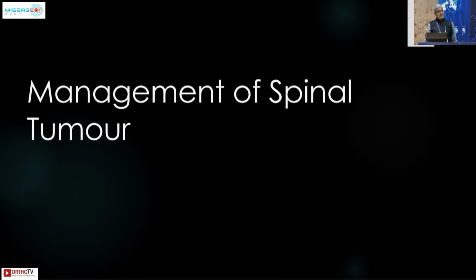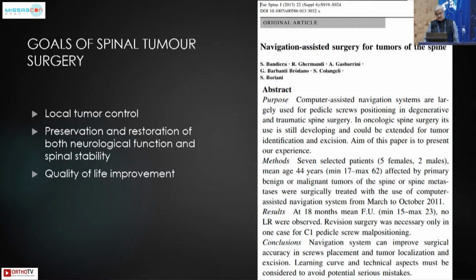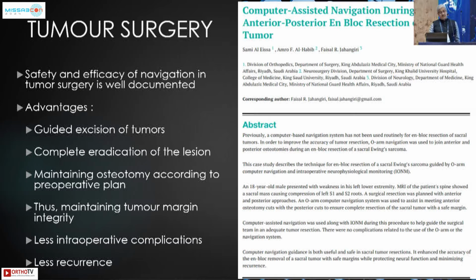Coming to the management of spinal tumors, it is well documented that the navigation system can improve surgical accuracy with screw placement, tumor localization, and excision of the tumors. It is also well documented that it can be safely and efficiently used with a number of advantages: it can guide the excision of the tumors, help with complete eradication of the lesions, maintain the osteotomy according to the preoperative plan, and maintain the tumor margin integrity, with fewer intraoperative complications and lower recurrence rates.